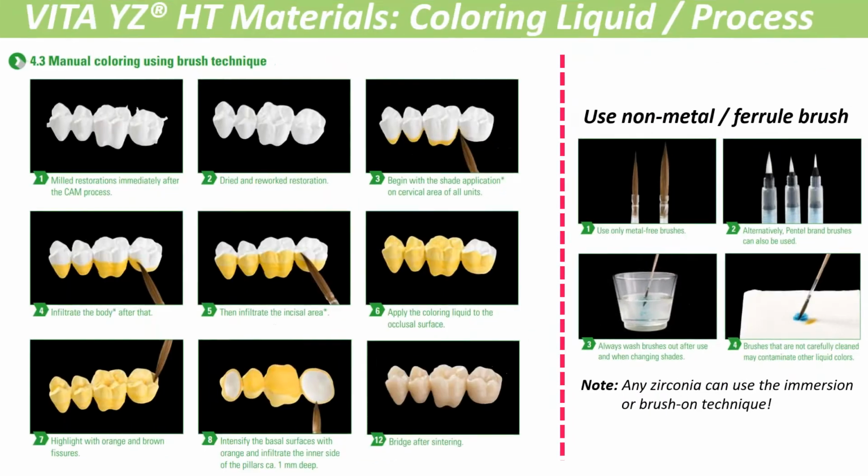Another technique is the brush technique. And I don't color a lot of my zirconia anymore, but when I do, this is the way that I prefer to do it. It usually gets me a lot closer, and I have a lot more control over how much I'm adding and how much I'm going to affect the actual color change.